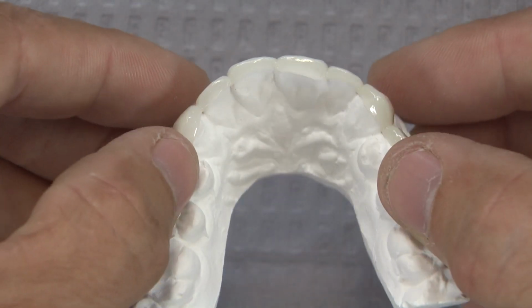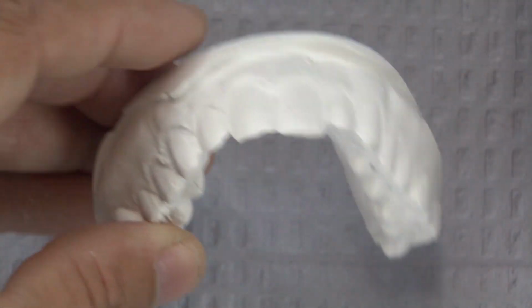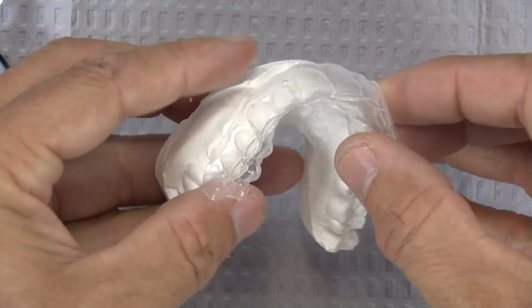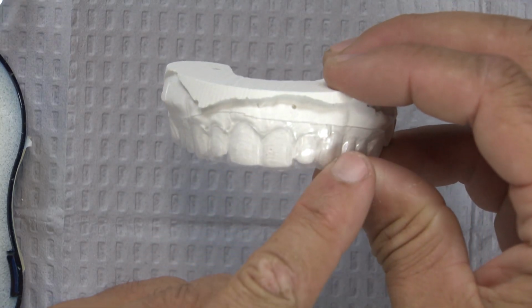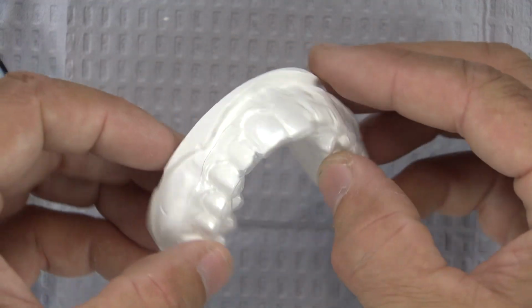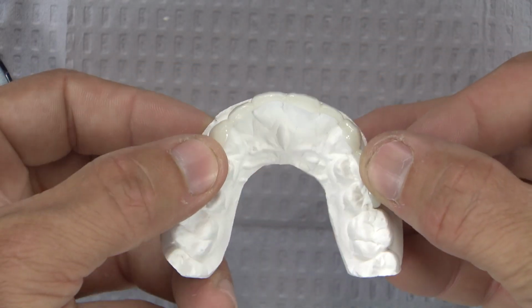Keep in mind that the virtual preparations are designed with draw in mind, so the biotemps seat nicely without getting hung up on the model anywhere. This does not always translate exactly the same in the mouth, when my doctor is more concerned about occlusal space and minimal reductions. You can also request your biotemps temporaries to arrive with a plastic prep stent similar to the stent that arrived with your diagnostic wax model, but in this case, it shows the virtual preparations that your Gladwell Labs tech has made and can assist in verifying the draw of your temporaries and your doctor's overall ideal reduction.